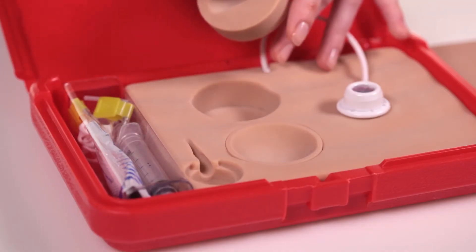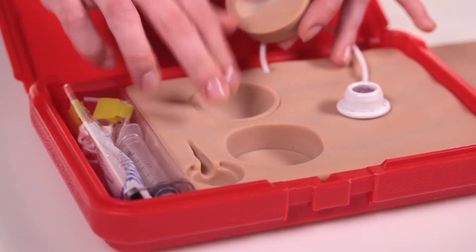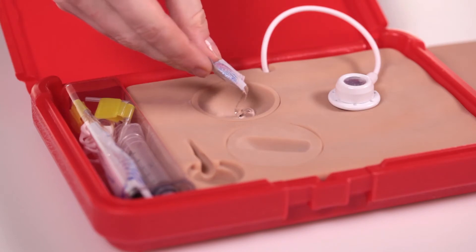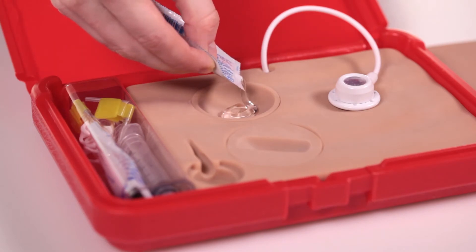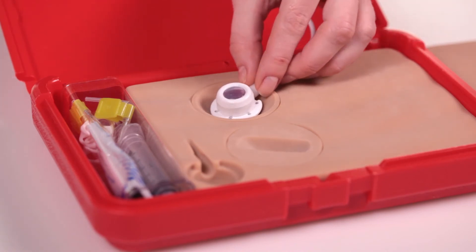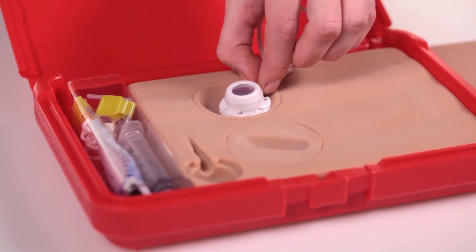There are two interchangeable round inserts in the tissue block, items 5022 and 5023. Item 5023 will simulate a wandering or floating port when the supplied lubricating gel is placed in the center of the round insert, followed by the port and then covered by the skin flap.